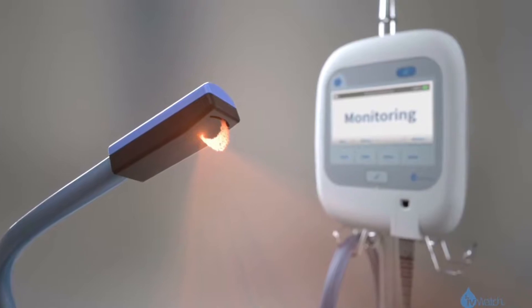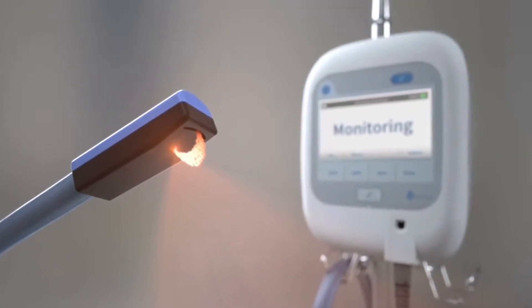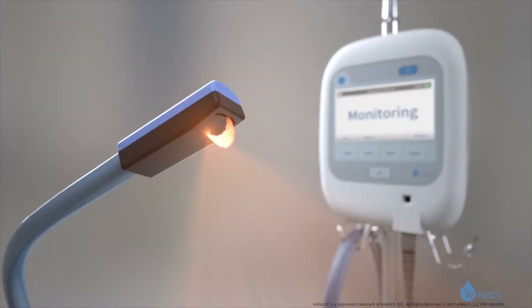The IV Watch Model 400 is a non-invasive device that aids in the early detection of infiltrations. It just uses visible and near-infrared light to continuously monitor the patient's IV site, and it's capable of detecting an infiltration far before there are signs visible to the human eye.